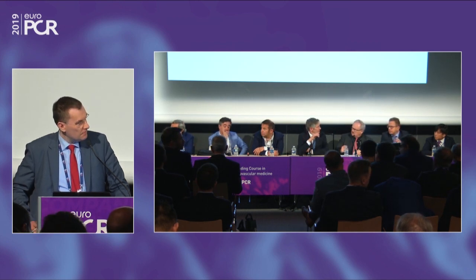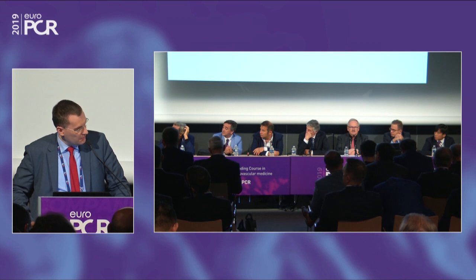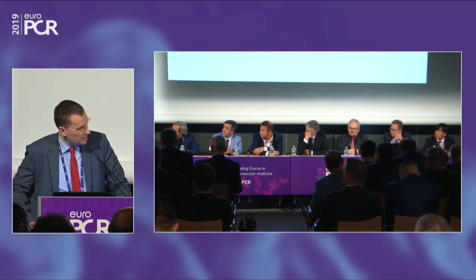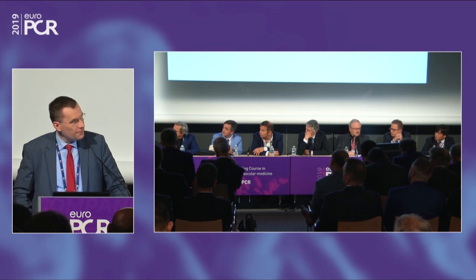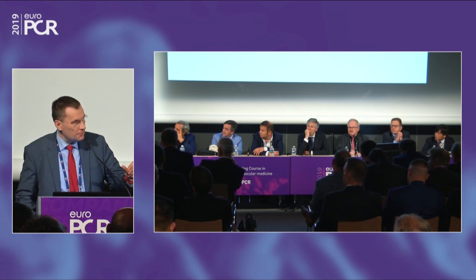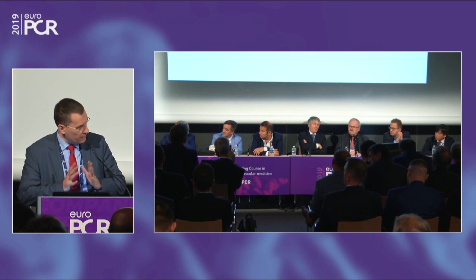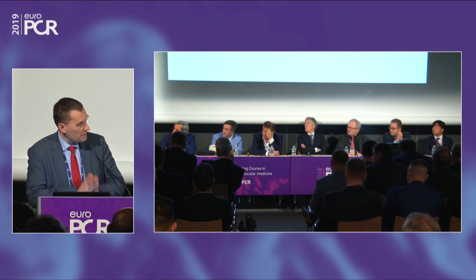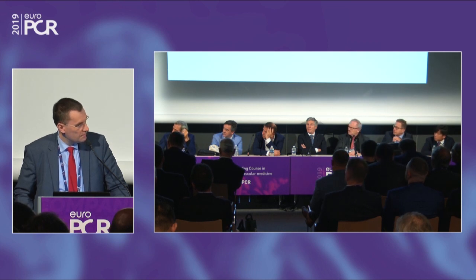I have one question. Excuse me, I didn't realize. Were the two stents identical diameter? In this case, yes. But can we utilize different diameters, in culotte? You can. You can use any combination. You just have to keep in mind the proximal section: what is the maximum diameter which you can achieve with the post dilatation after stenting? I mean, just to have a good overlap.